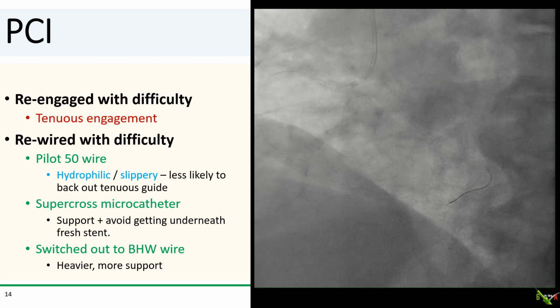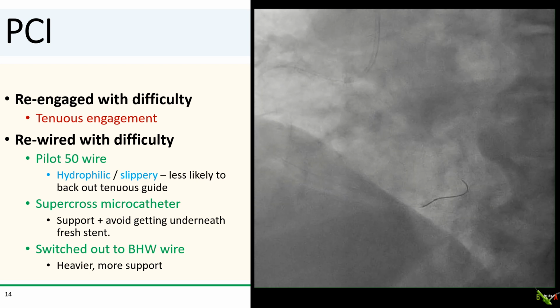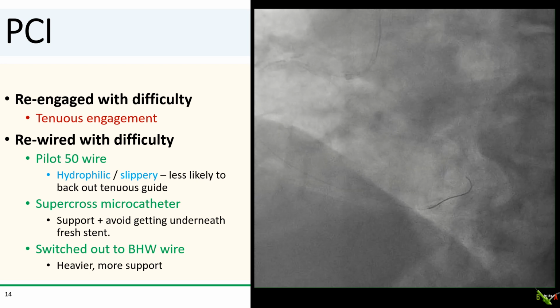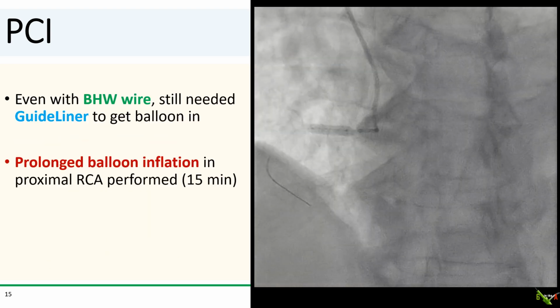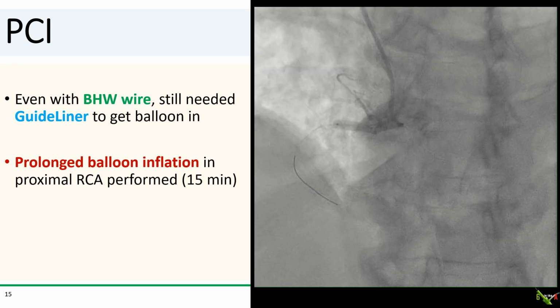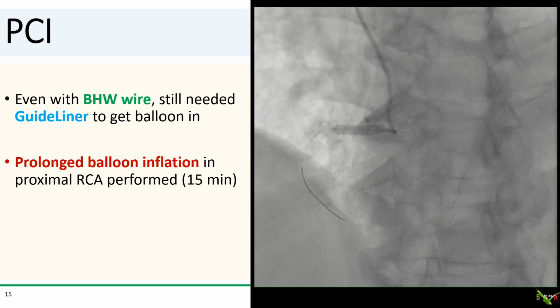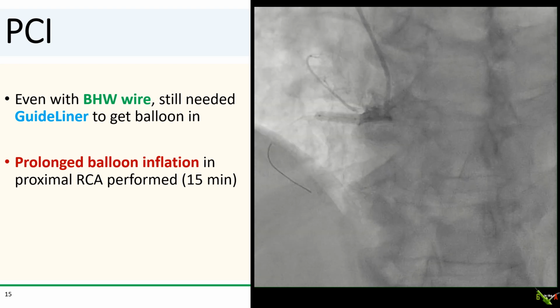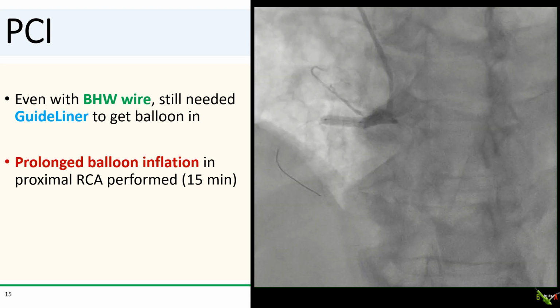We also used a Supercross microcatheter, both for the support and also to avoid getting underneath the freshly placed and not yet post-dilated RCA stent. And once we got the wire and microcatheter down, we switched it out to a BHW wire for more support. But even with a BHW wire, we still could not get a balloon into the proximal RCA until we used a GuideLiner. And finally, we did a prolonged balloon inflation, 15 minutes in the proximal RCA, hoping to close off the mouth of the dissection.